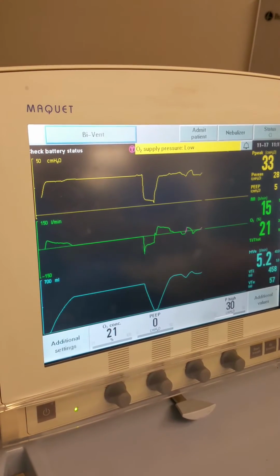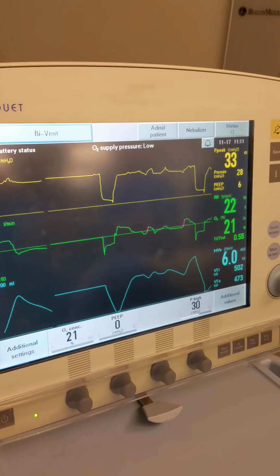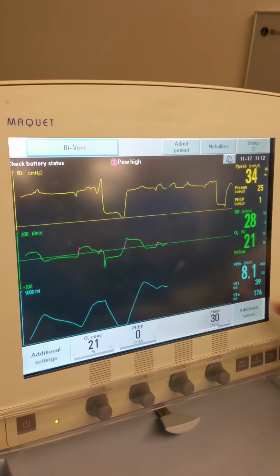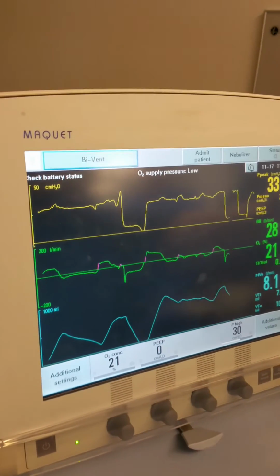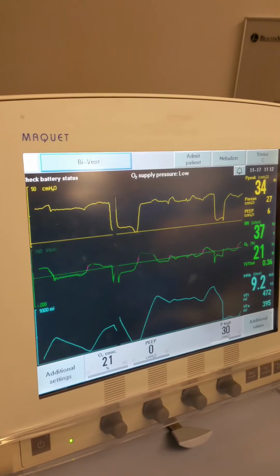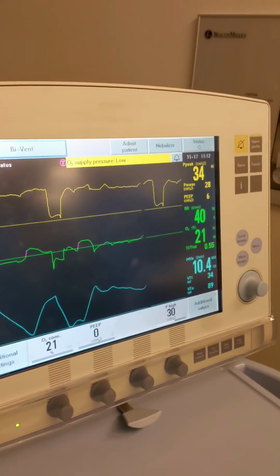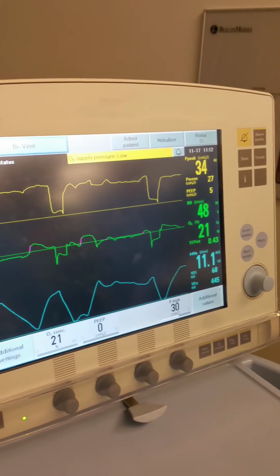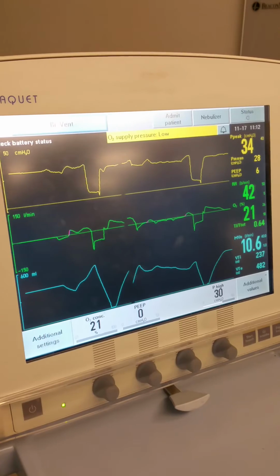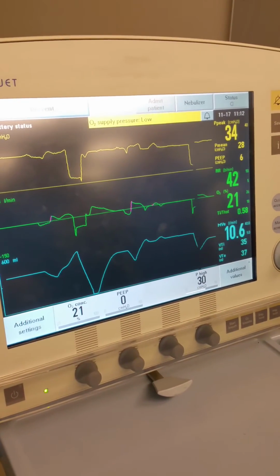Let's say that they become really compliant, they got a bunch of Lasix, all of a sudden they're getting big tidal volumes of like 800. What do I want to do? Then I'm going to decrease P high. It's the same concept as delta P. Yeah, it is pretty much. This is a pressure-based mode, so yeah, it's the same concept.